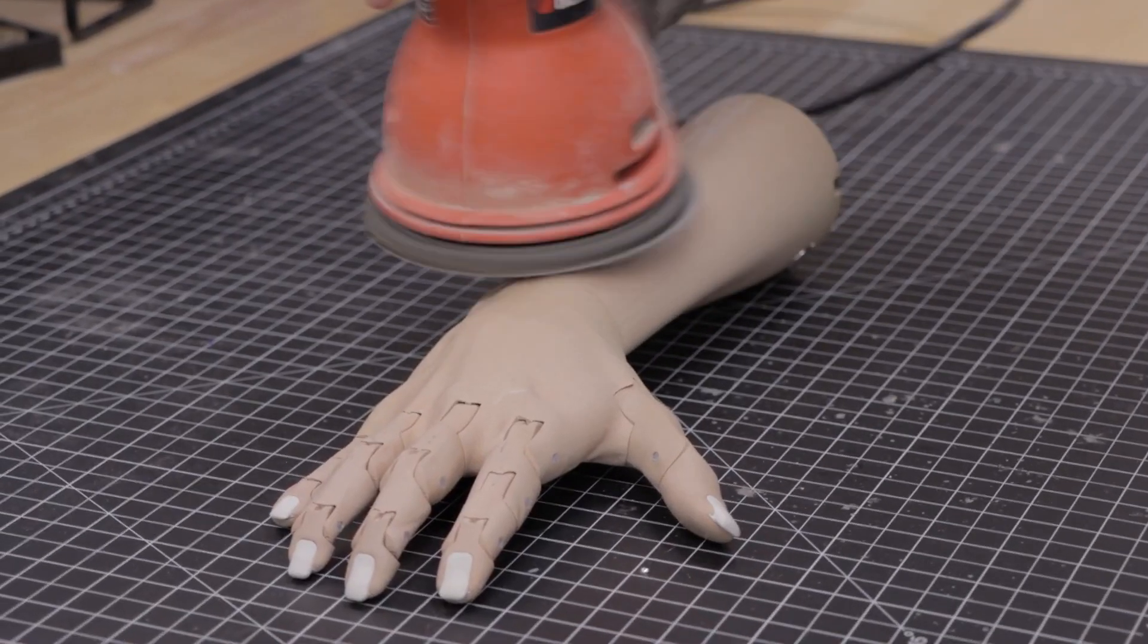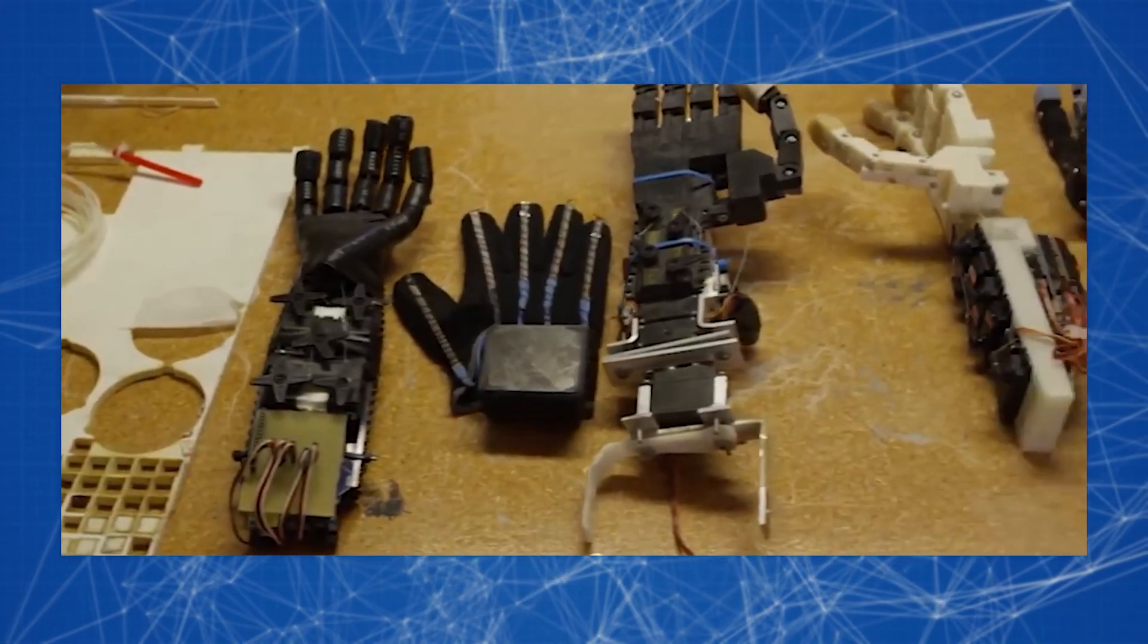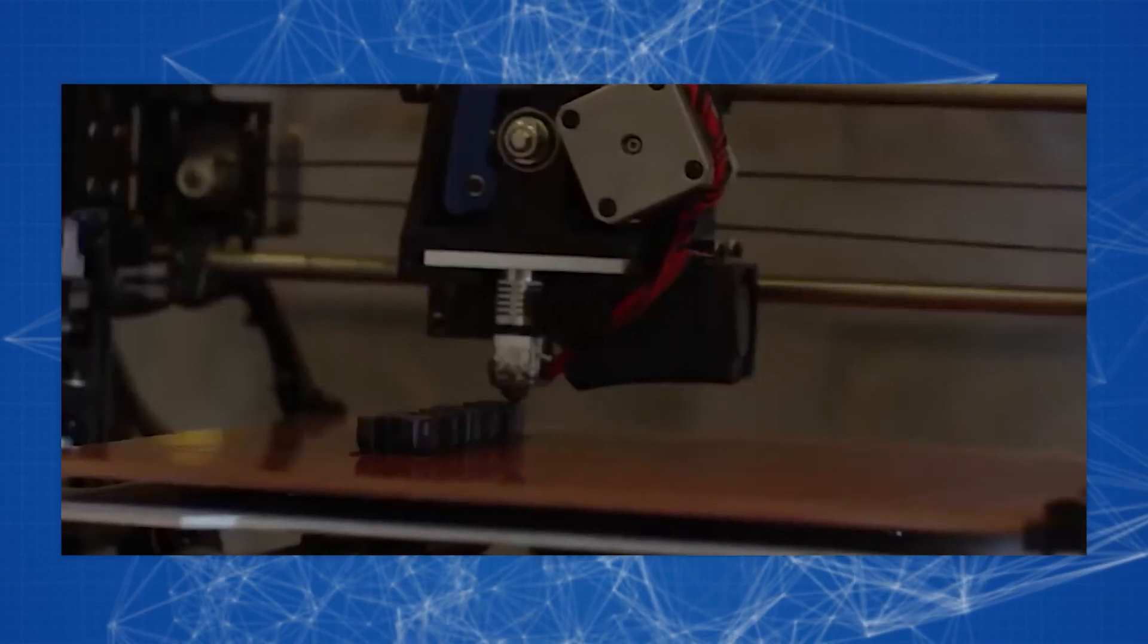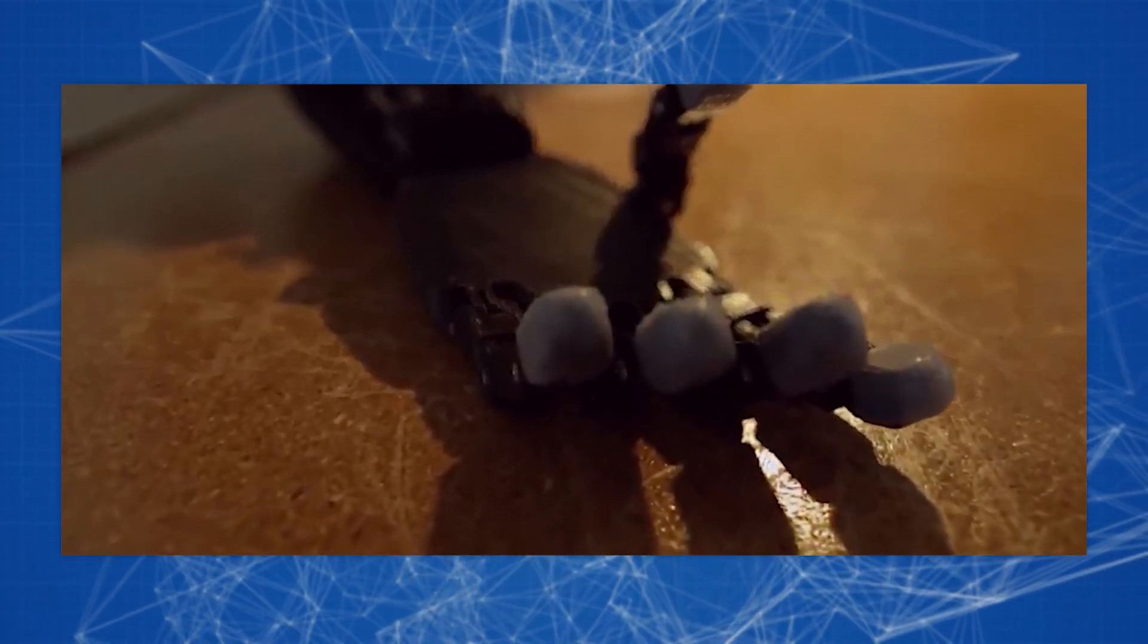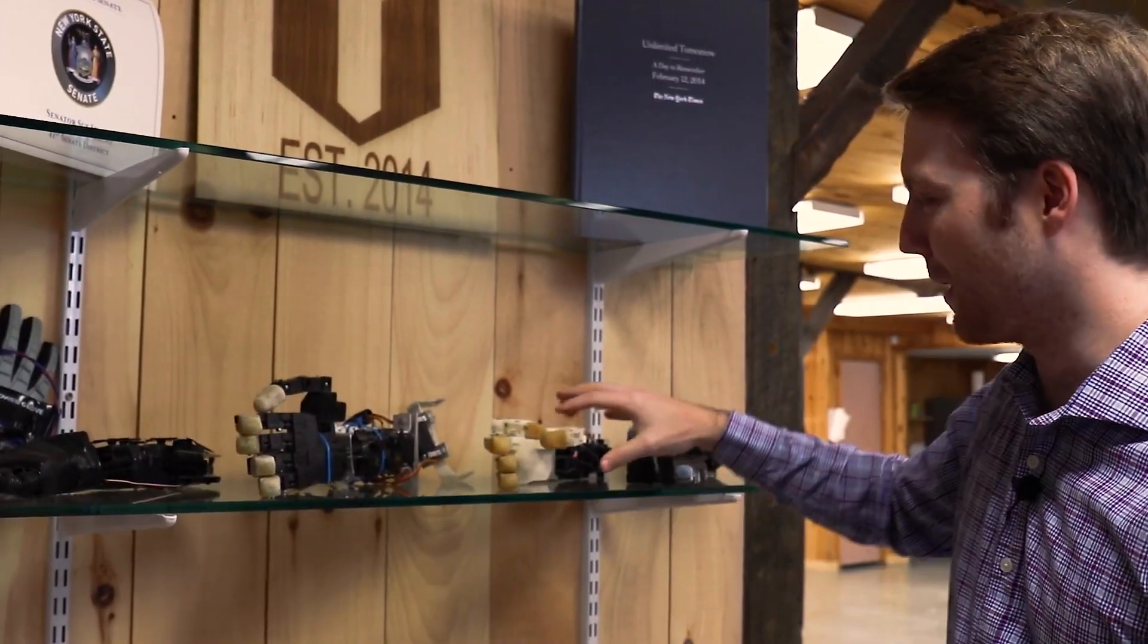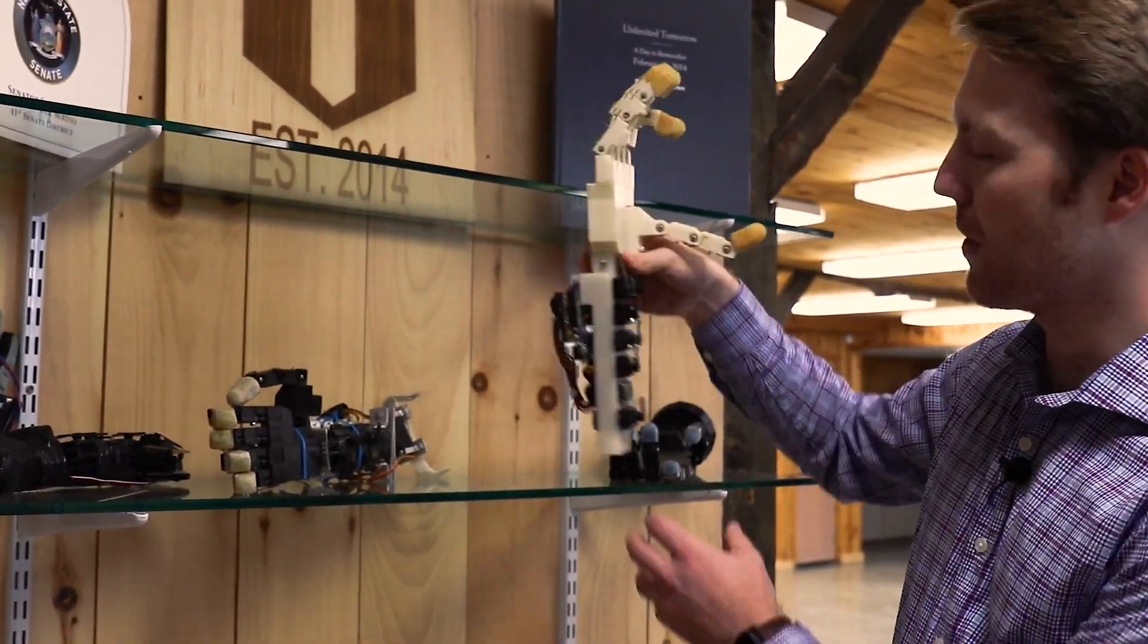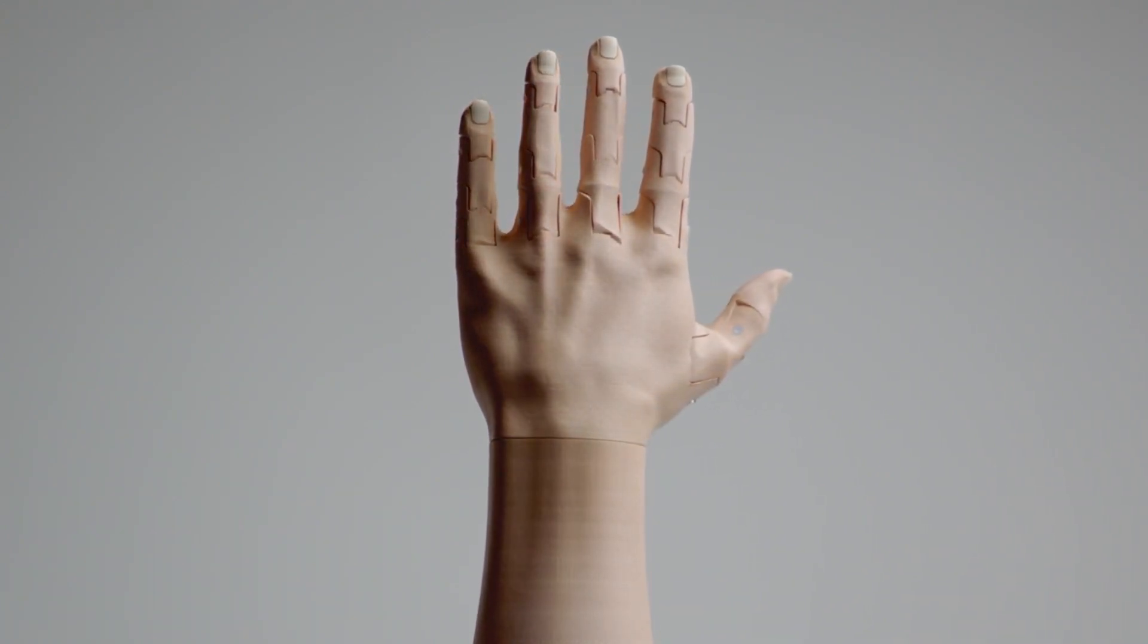In terms of functional characteristics, the TrueLimb prosthesis is not inferior to its expensive analogs, but due to 3D printing and the absence of unnecessary links in the production chain, such as prosthetists, third-party suppliers, and developers, such a prosthesis is 5 to 10 times cheaper than models of a similar level. The bionic arm designed by the Colorado genius has many convenient features that were previously only used in fabulously expensive models.